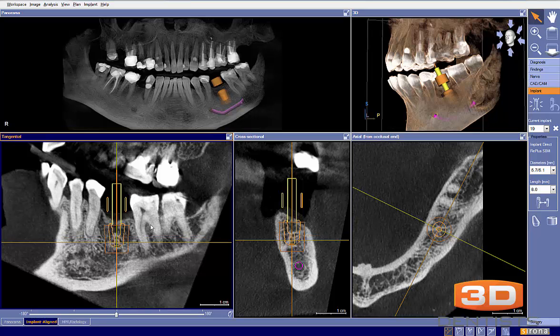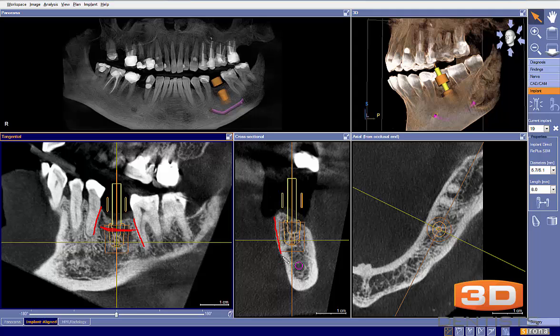What I'm looking at mesiodistally is: are we pretty well centered between the roots? And we look to be pretty well centered. Then I'm going to look buccalingually — are we pretty well centered between the buccal plate and lingual plate?